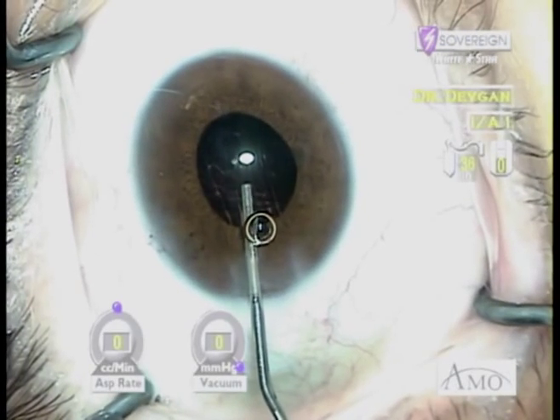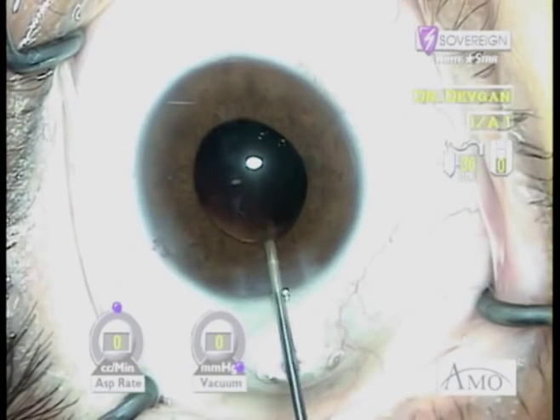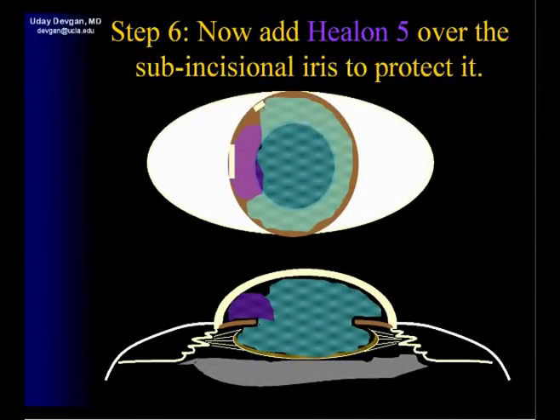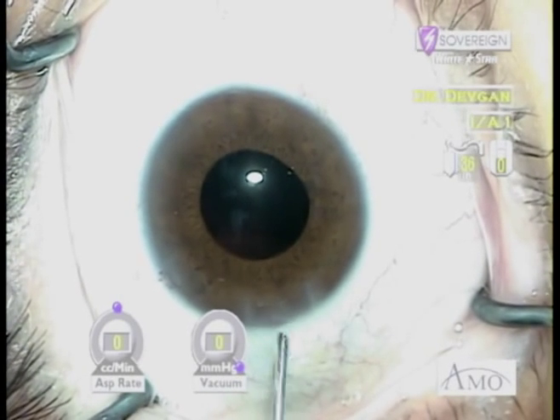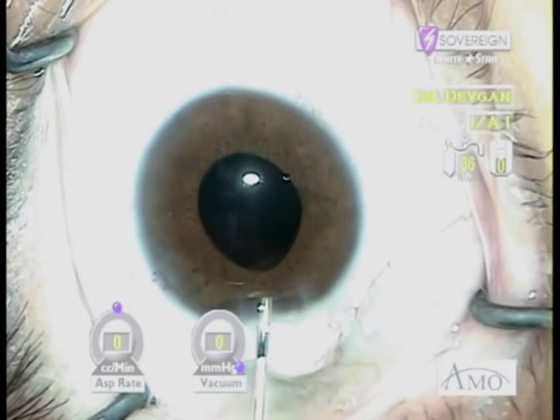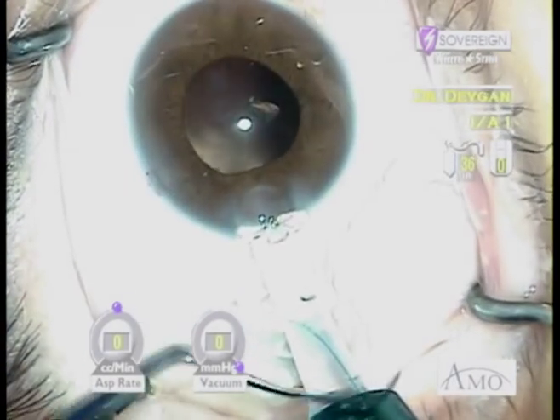At this point we're going to fill the capsule bag with our normal dispersive viscoelastic — this is what we're used to. On top of this we'll add a small plug of Helon 5 at the sub-incisional iris to protect it and further depress it. Adding this Helon 5 at the sub-incisional iris allows us to insert the IOL injector without fear of contacting the iris.